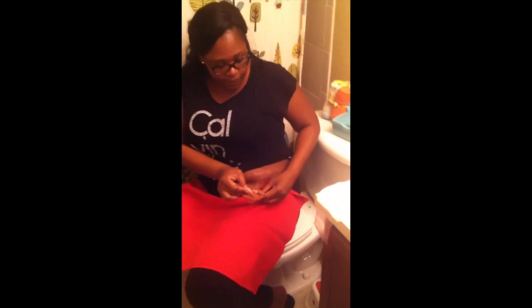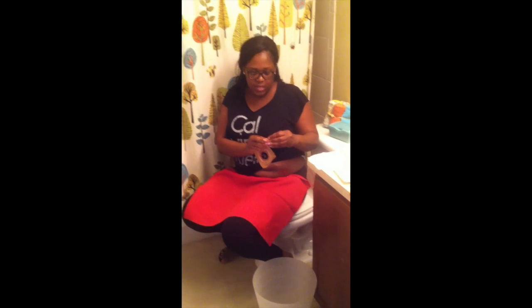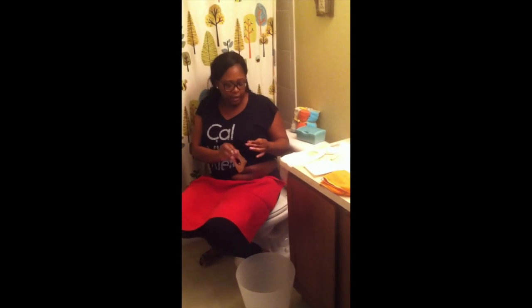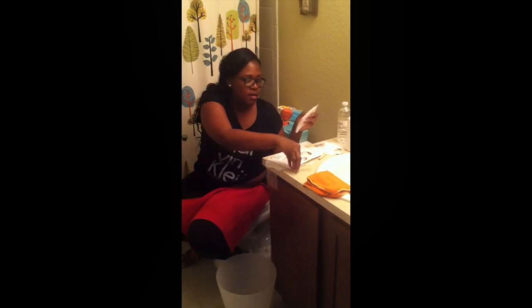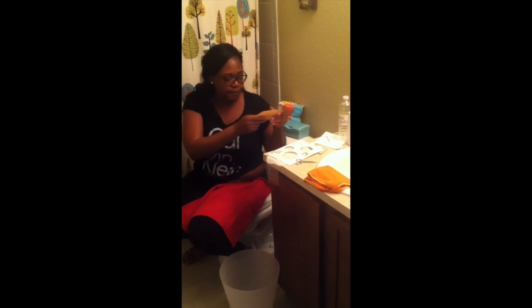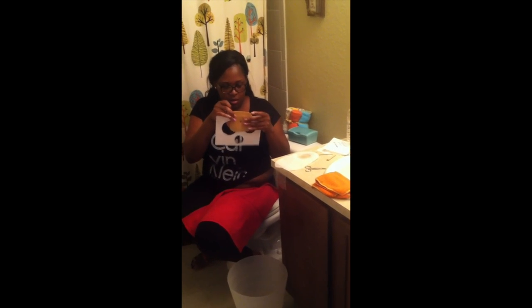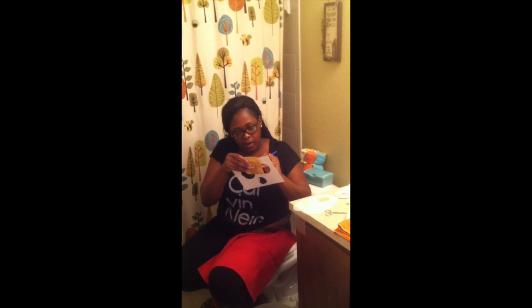Do they suggest testing the skin with the adhesive prior to administering the glue? Yeah, you want to make sure that you test it so that you don't have any allergic reactions beforehand. You'll piece it out of the package like so, and go ahead and measure it around with the marker — the actual size of the stoma.